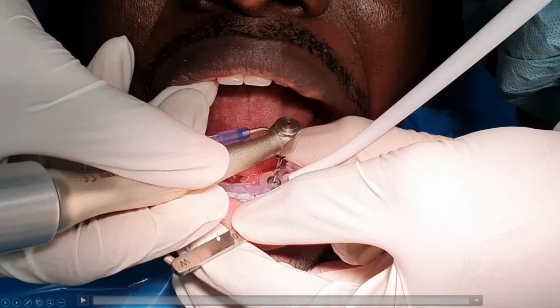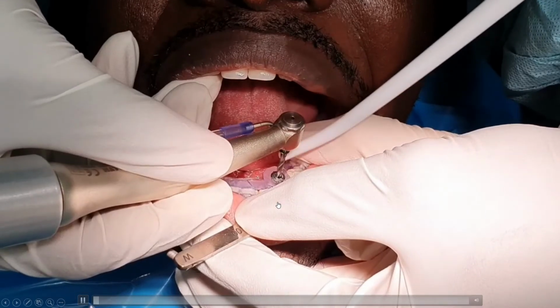We've lifted no flap. You can see the W is showing there. It's not possible to fit the W side in because this recess is not large enough to allow that to go in. So there's a safety feature there. And you position the burr within the guide. Do not start the burr until such time as it is inside the guide. You don't want it running around trying to find the access. So you position it and then you're ready to go.